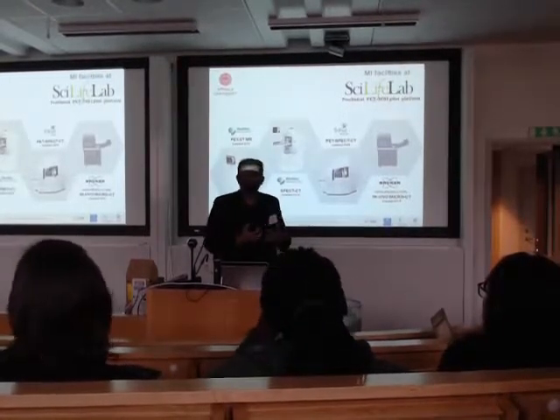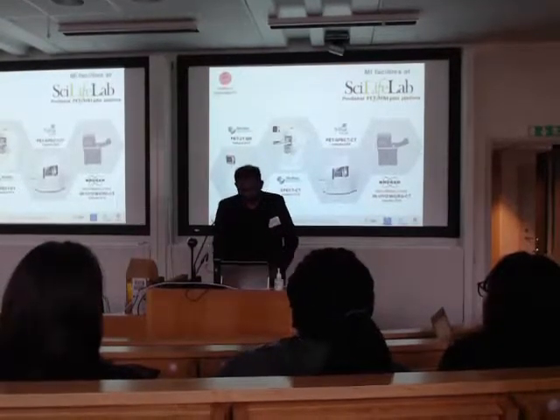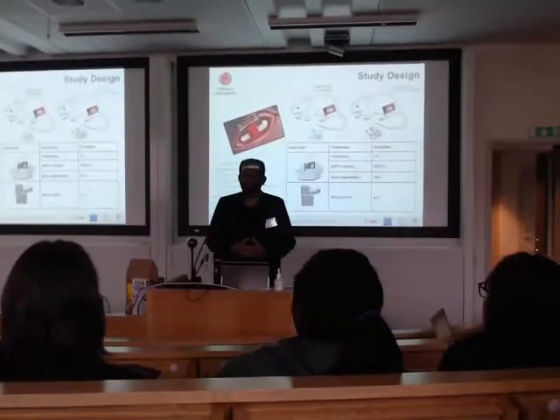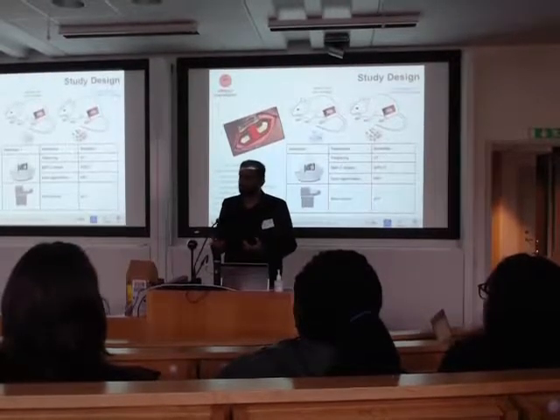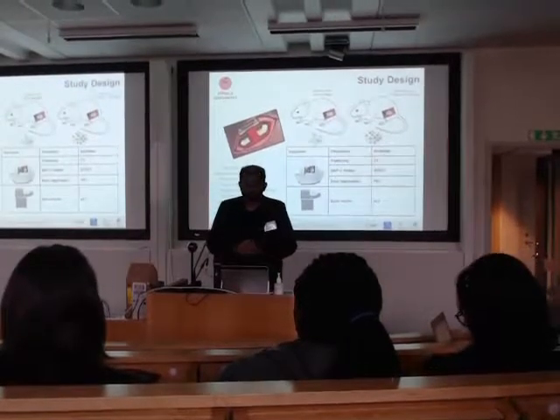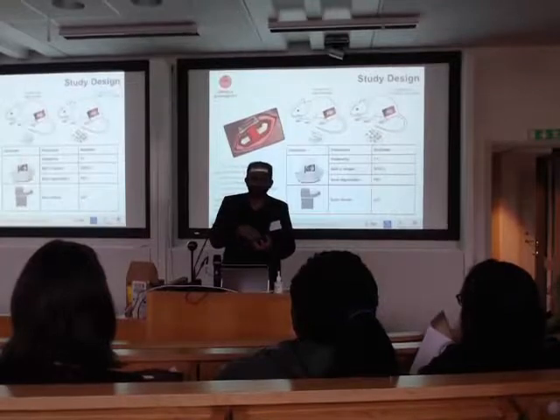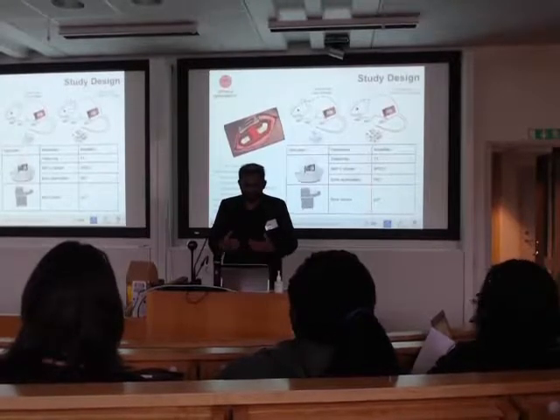So I'm going to give you an example of how we use these imaging modalities to follow an in vivo process. I will just give the study design. Here we try to evaluate something called smart material. Smart materials are those which carry special proteins, in this case bone morphogenesis protein, which helps in quicker bone regeneration at the site of surgery. The aim is how good the carriers are. The smart materials carry this protein, and that protein should help in bone regeneration. So we use these modalities to follow this process.